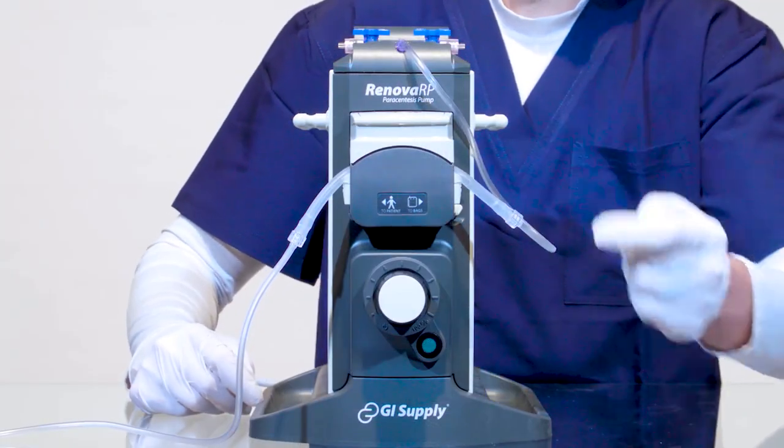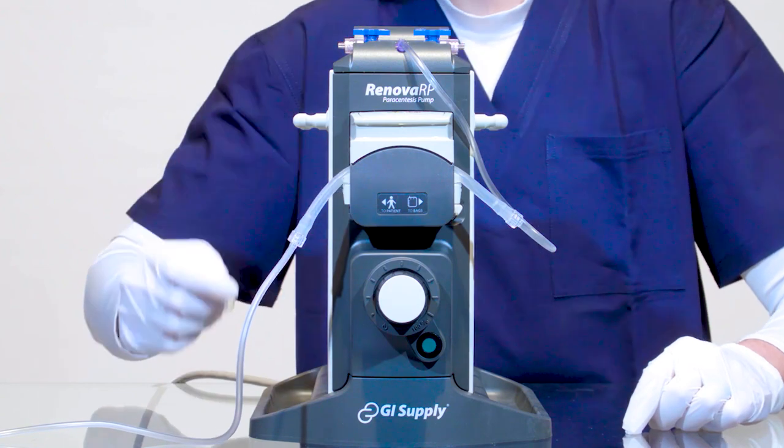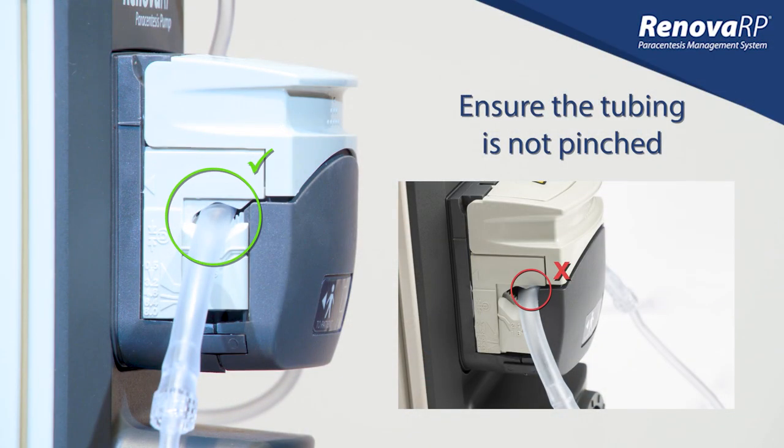At this point you want to ensure that the tubing has not been pinched on either side by the flip top. Double check this before moving on.